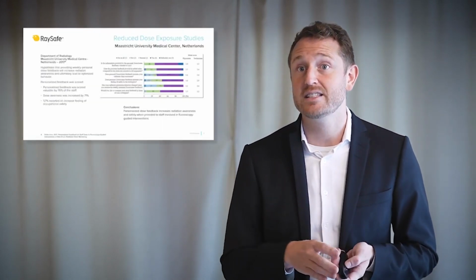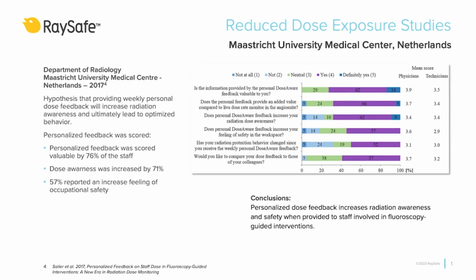Real-time dosimetry effectively reduced staff radiation exposure in the cath lab. This change was caused by optimized use of existing shielding equipment since no modification of the general procedure approach or patient characteristics had occurred. The fourth study was approved by the Institutional Ethical Committee.